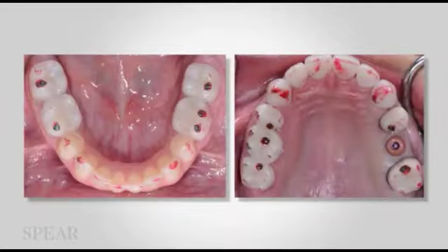So what I did, because this is the beauty of trusting this process, is I put two leaves in there, so two leaves of a leaf gauge. I had her slide forward, back, and squeeze, created just a little bit of space between the back teeth, right where we wanted her to be. Plopped a little composite on those landing areas on the top provisionals, had her bite into it with the two leaves, and zap the composite. Now, does that look exactly like her appliance does? Does that look exactly like physiologic occlusion? Yeah, and it was predictable for me because I knew how we got there in the first place. So she was back to perfect again.